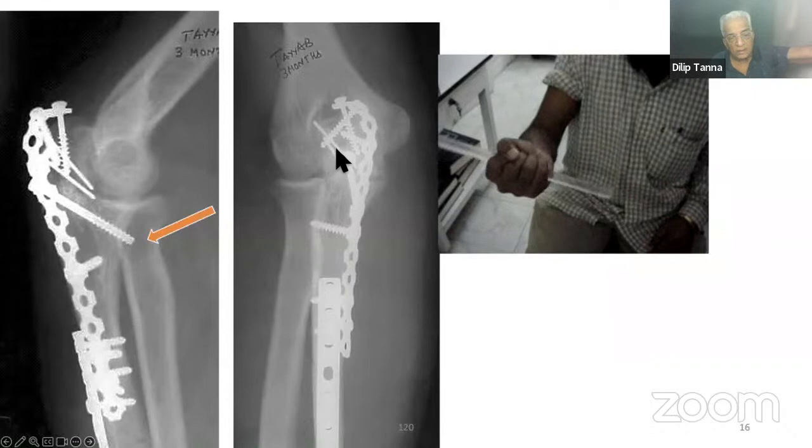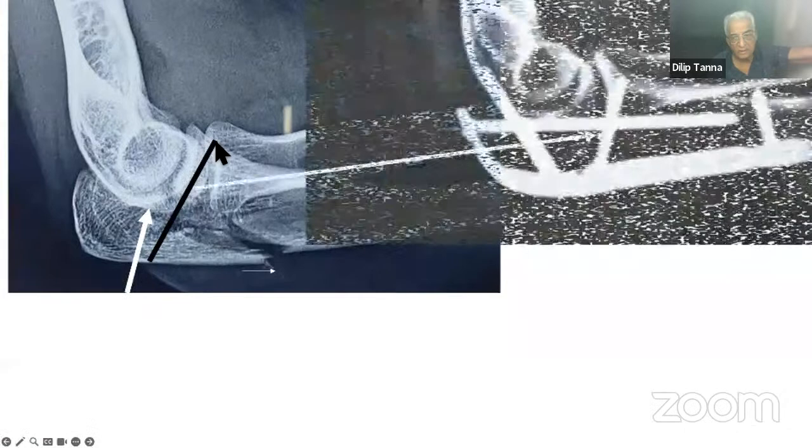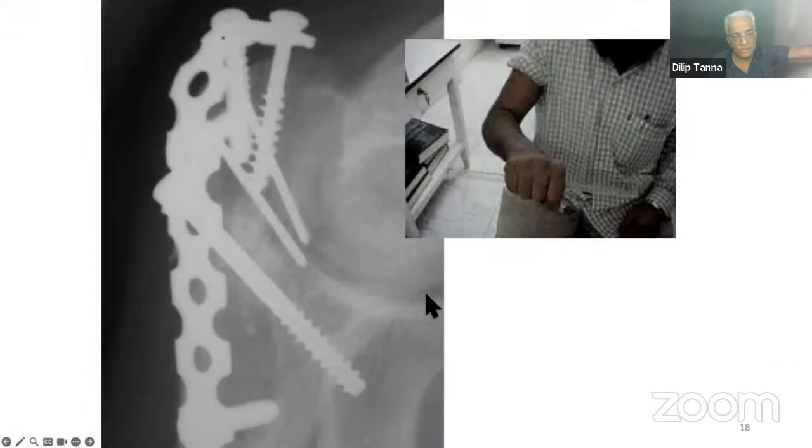Now here, you can see the ideal thing is this. This is the screw which you must fix first. Now here you can see an excellent range of movement in this patient.